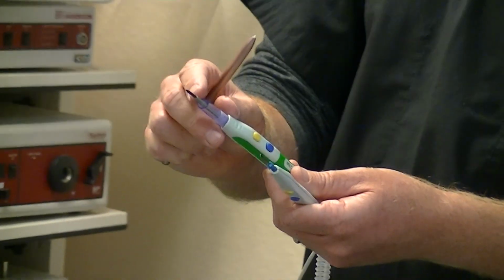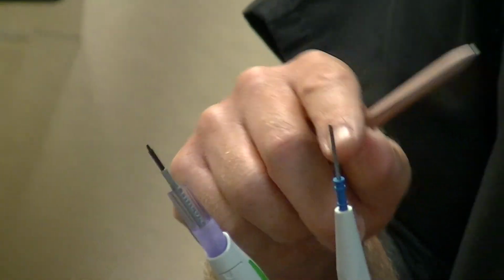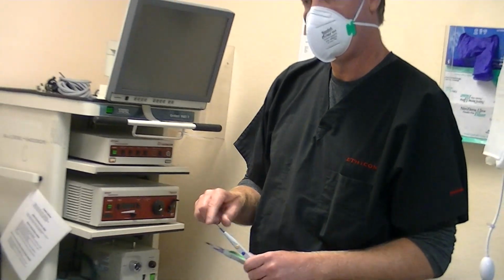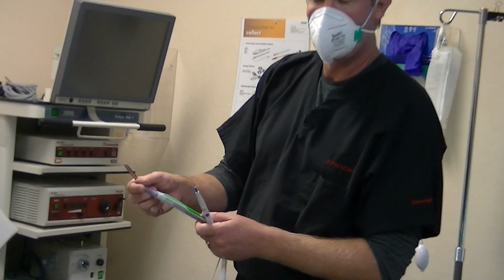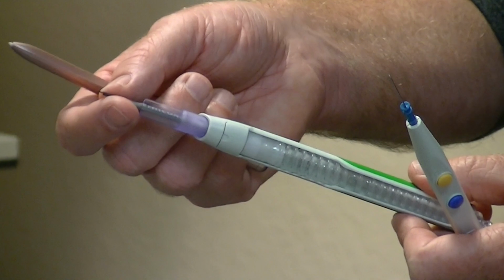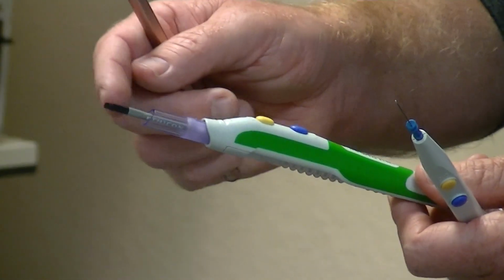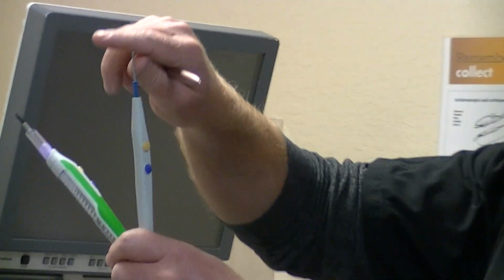Some are different than others, and we'll go into it. Some of them have a modified tip. This is stainless steel, and we'll talk about that. You're going to have a stainless steel tip or a non-stick tip, sort of like Teflon, where it just wipes away, because eschar is part of the fuel in your fire triad. The modified tip is for when you're deeper in surgeries or they don't want energy on excess areas or causing issues with other tissue. You have a modified blade where the last 2 or 3 millimeters are active, compared to this blade, where this whole area is active, so you have to be aware of that energy and where it's going.